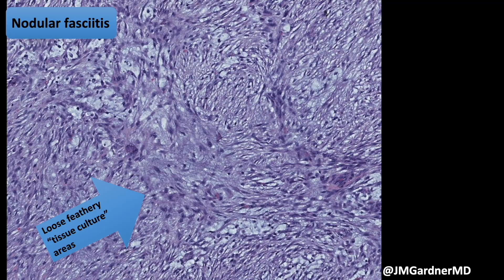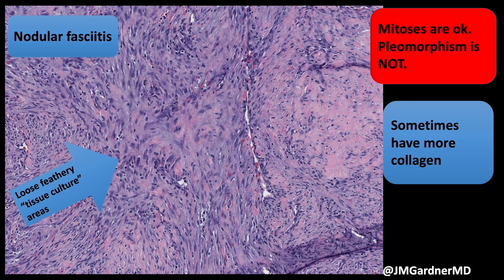Here's another case — a variant that looks quite different because it has a lot more collagen. Sometimes you get very loose myxoid nodular fasciitis; sometimes you get very cellular, mitotically active lesions, particularly in the early cellular growth phase. In older, burnt-out lesions they become more sclerotic and collagenized. Here we still have a feathery tissue culture area where the cells are not only spindled but jagged, pointy, triangular, or stellate-shaped. In other areas you can have sclerotic collagen.